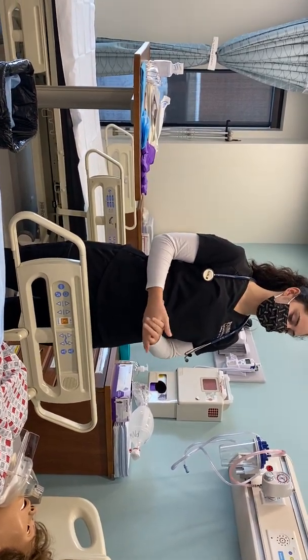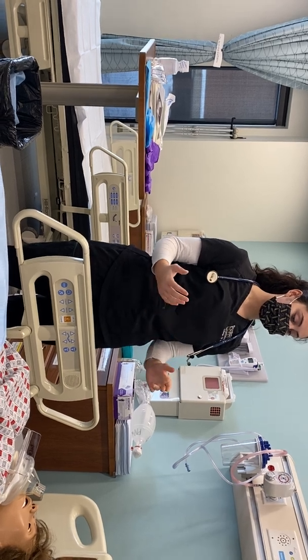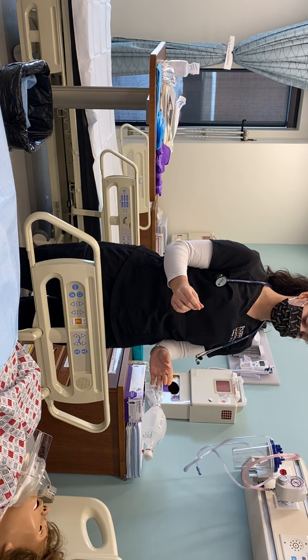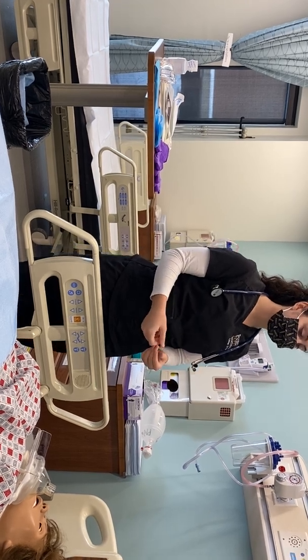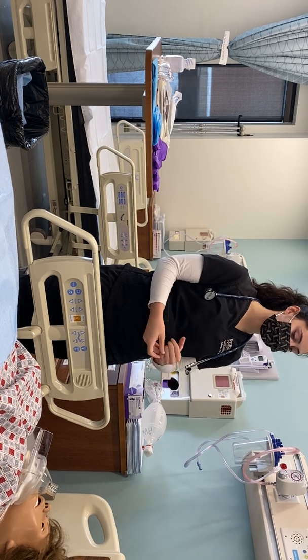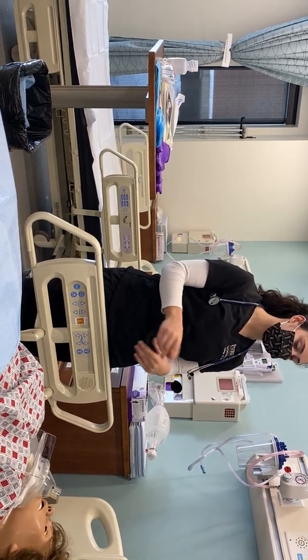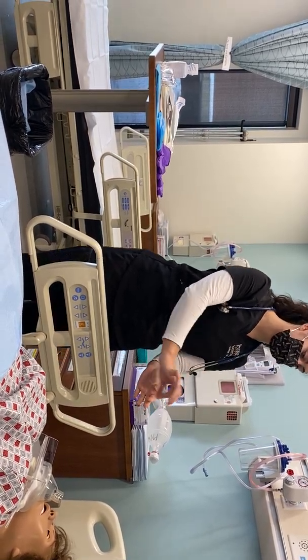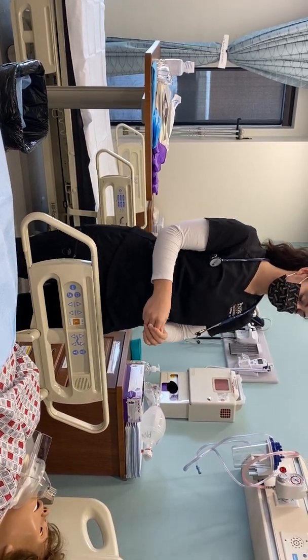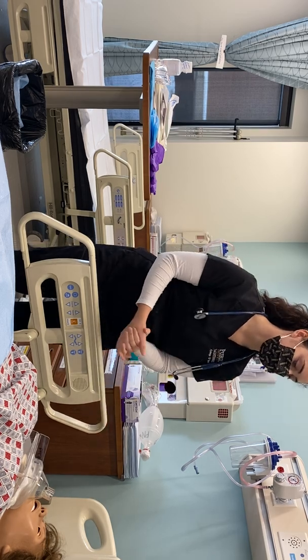Okay, sounds good. And then just to let you know how the procedure will go, I will be suctioning out your trach and then basically cleaning it out. This is done because it'll help you breathe better. That is why we do it. What we do is exactly just that, suctioning with a suction tube and then cleaning it out around there and giving you a brand new little tube to go in there as well, okay?